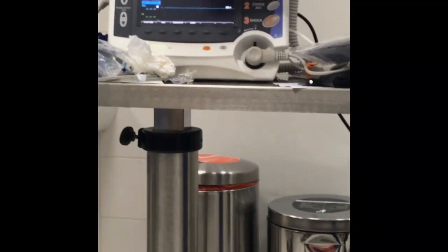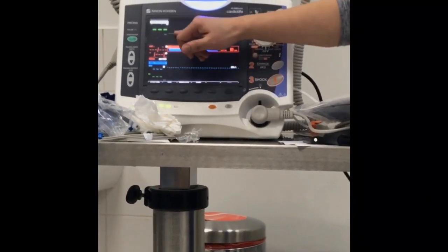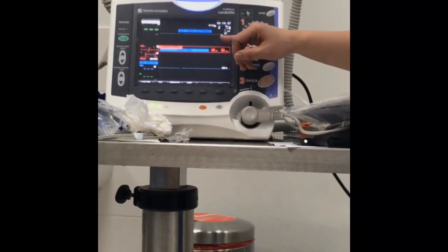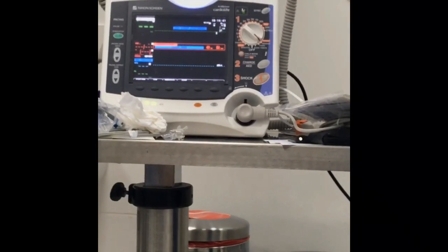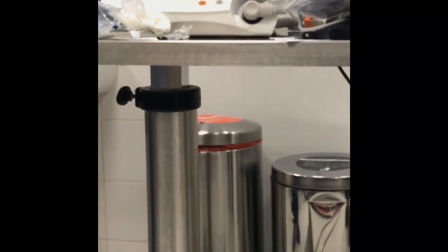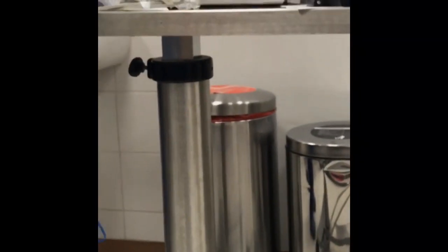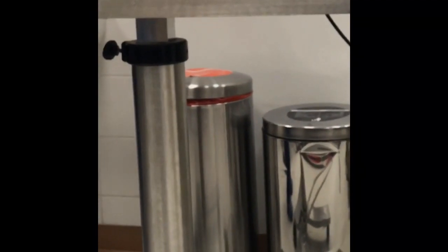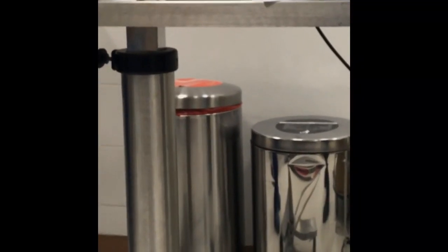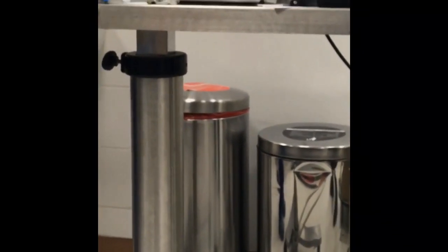That is why you need to put also the leads, the ECG electrodes. We will be providing three leads for the ECG. Remember, you have the pads here and here, and your leads will be up here and here. So as much as possible, don't put your electrodes where the pads will be. Clear this part and put the electrodes here. Without the electrodes, if you do the pacing, it will not capture. Without ECG.